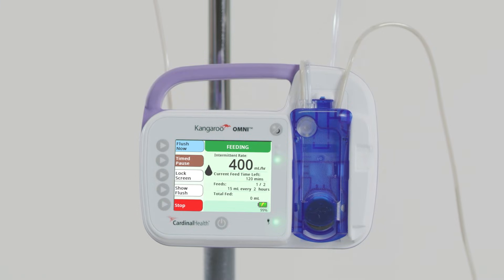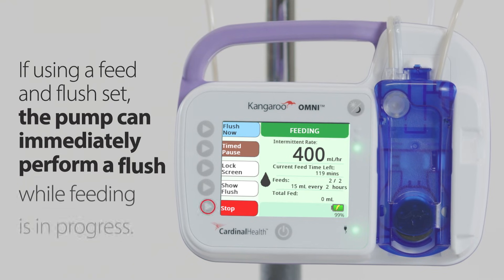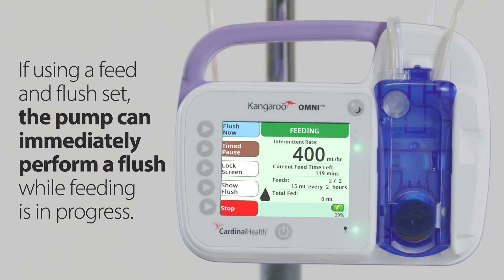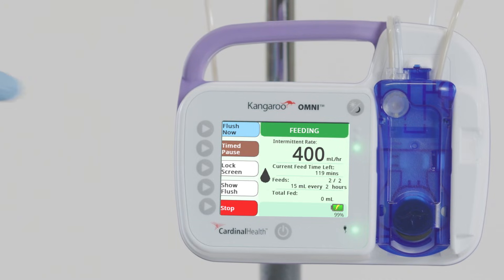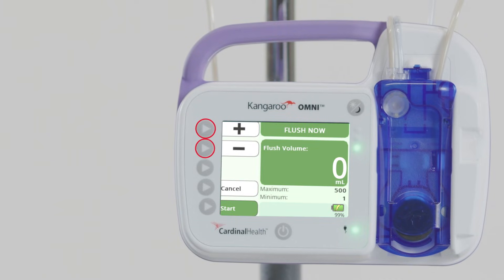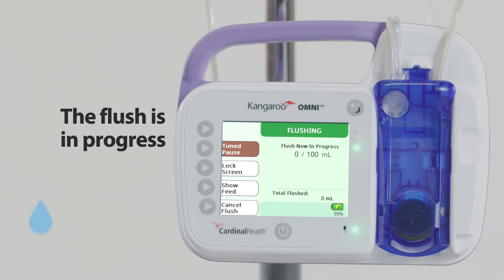Additional options are available while feeding is in progress. To stop feeding, press the Stop button at any time. If using a Feed and Flush set, the pump can immediately perform a flush while feeding is in progress. To do so, press Flush Now, then use the plus and minus buttons to input the desired flush volume, and press Start to begin the flush. A screen with an animated blue droplet will appear, indicating the flush is in progress. The pump will automatically start feeding again once the flush is complete.